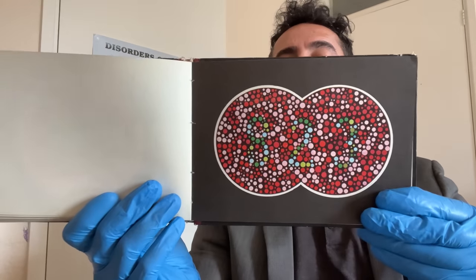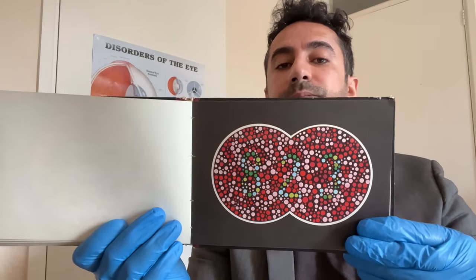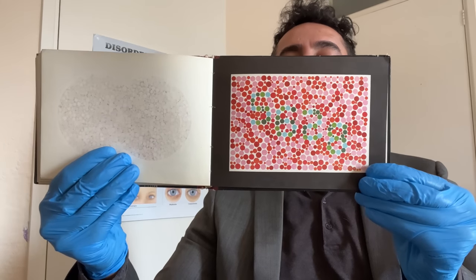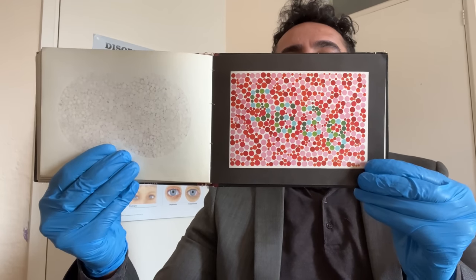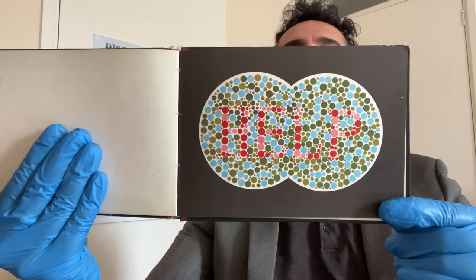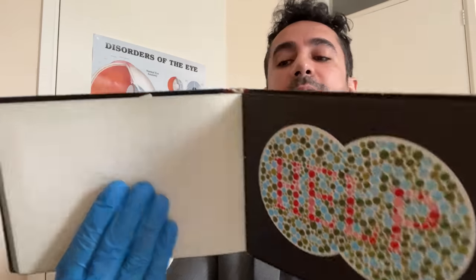Take your time on this one please. What can you make out there? I believe there's just a couple more to go — actually we have one more to go. Final plate there — what can you make out please? Excellent. So I hope you've enjoyed seeing the rare colour vision test there. Now let's move on to some old classics.